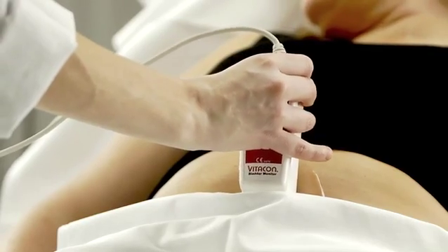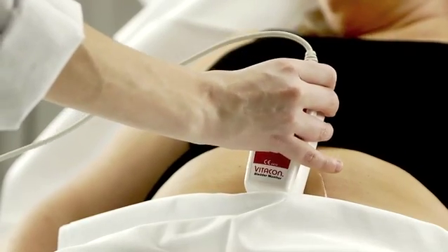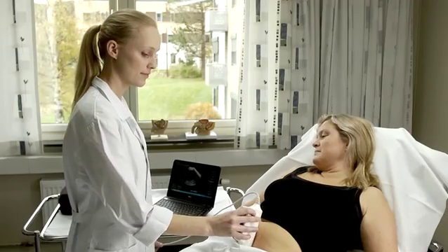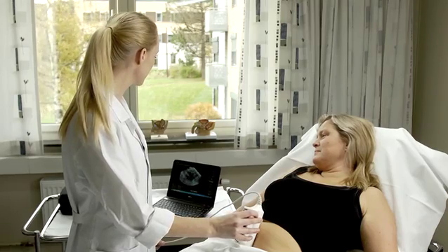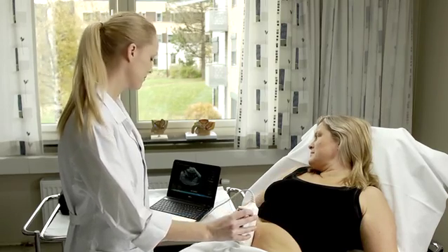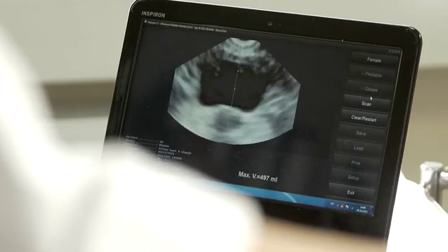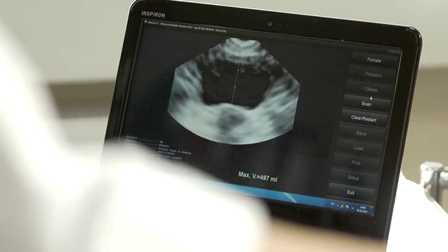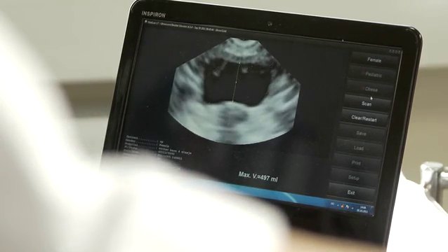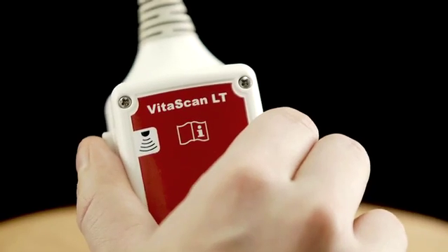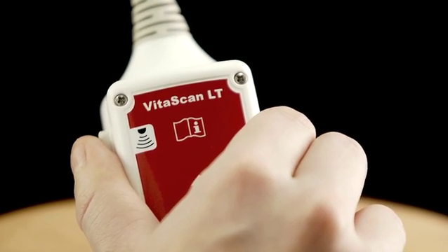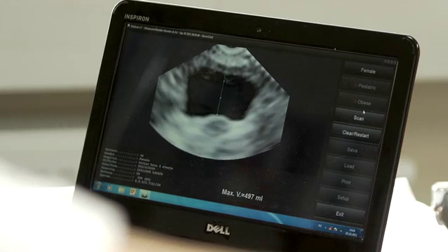Move the probe to find the patient's bladder. It should be found in the mid part of the patient, directing it down toward the rectum. When the bladder is well seen in the center of the image, keep the probe in this position and press the Scan button on the probe or on the PC.